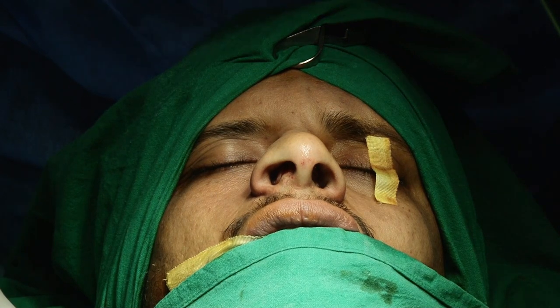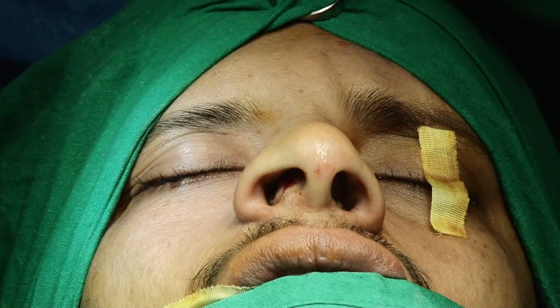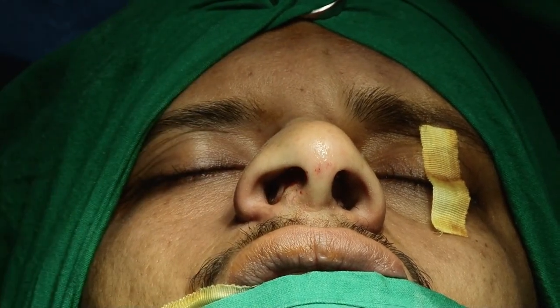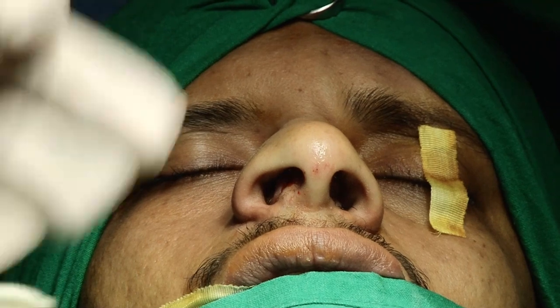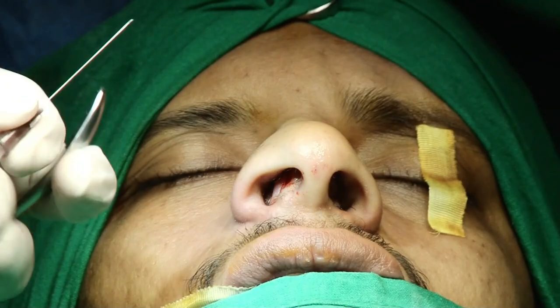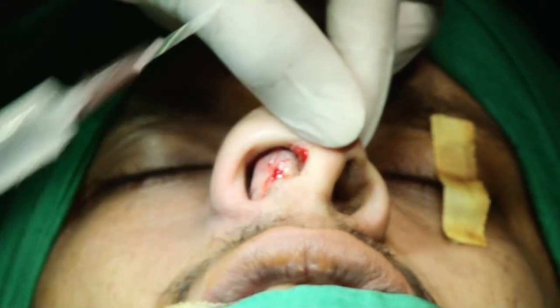First we infiltrate along the side of the incision in the septum, then the second stage for the transcolumellar incision, the third stage for the marginal incision, the fourth stage for dorsal degloving, and the fifth stage for the osteotomy along the lateral nasal bone. So first we infiltrate along the site of the incision in the septum. Look at the septum of this patient.